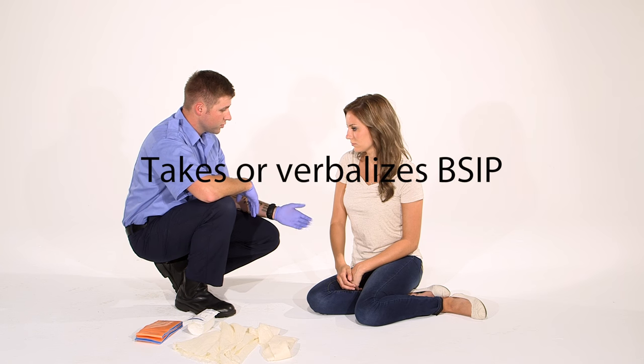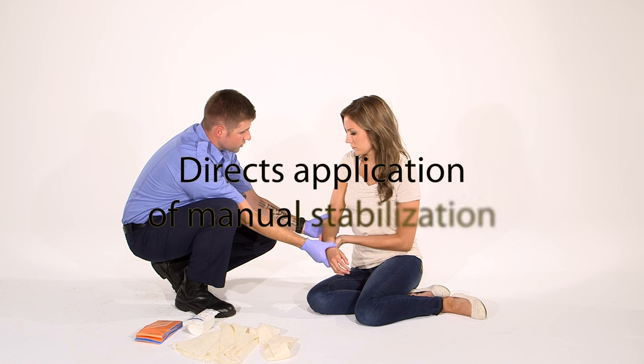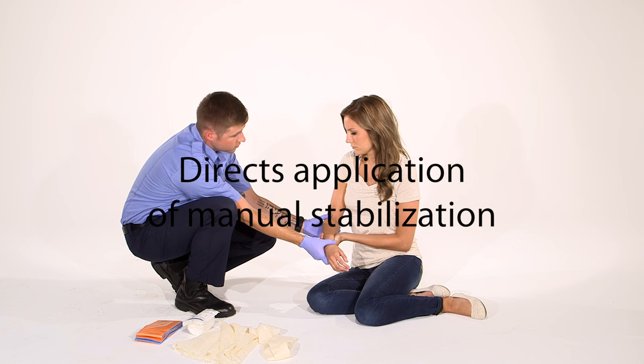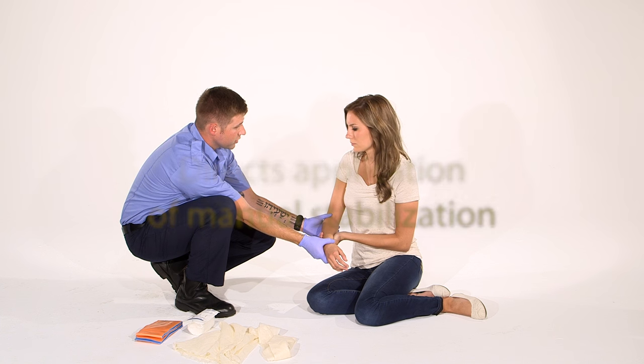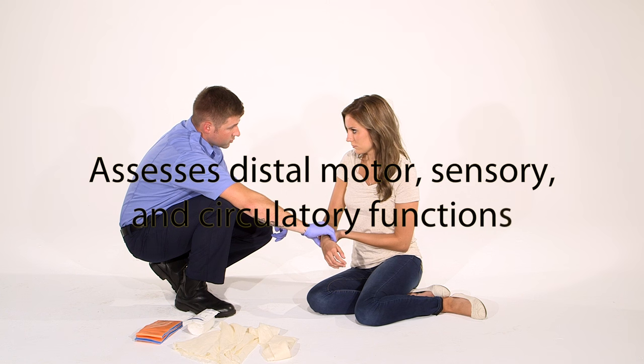I noticed that I have a long bone injury, so I'm going to manually stabilize and I'm going to have you hold in a position of comfort while I get other materials together until I can splint your arm. First, I'm going to check your CMS, so I'm going to check your pulse.